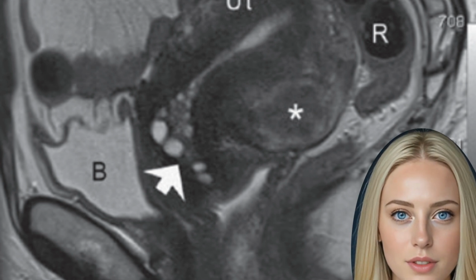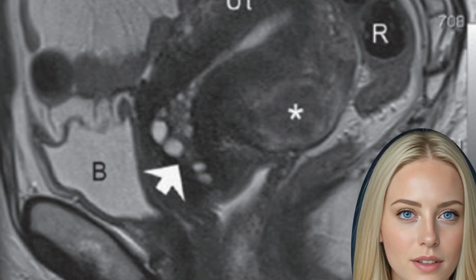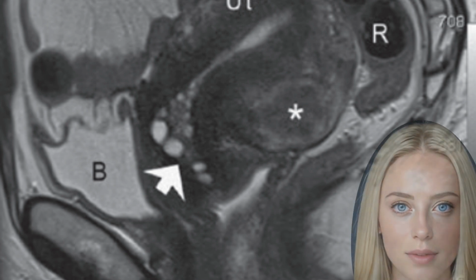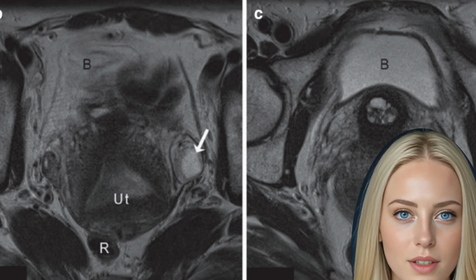With computed tomography, CT, using a multi-detector CT, MDCT, the examination of a region of interest can be performed in axial plane in a short examination time with sub-millimeter resolution. The raw data can be post-processed in any plane with approximately the same resolution. It should be noticed that intravenous contrast application is essential for soft tissue contrast, because even CT in venous phase has less tissue contrast compared to native MRI.